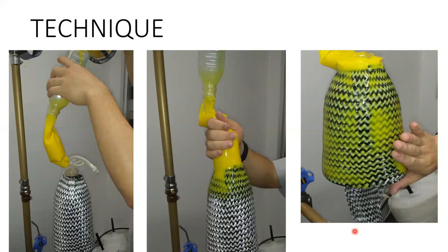So one of the things to think about also that can influence how our sockets come out is our technique. If we pour in the resin, turn on the vacuum, and we already have the bag tied off, but instead of letting the resin flow in by itself under the vacuum and gravity, we squeeze it in right away, what's going to happen is we'll trap air bubbles under the component. And so the best way to avoid that is to let the vacuum and gravity slowly feed the resin in. So instead of untying it and just letting it rush down, just let it slowly weep in. It'll start to work itself in the little areas and try to get all the air out. So you want to try to help your lamination as much as possible. Even if you're in a hurry, it's better to take a little bit of time now than to get a socket that has a lot of air bubbles, you can't get it out, and you're going to end up having to redo it.